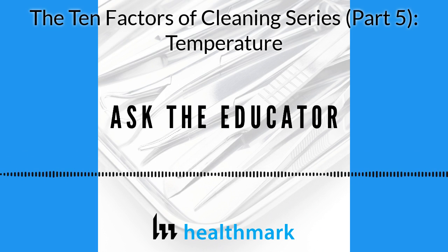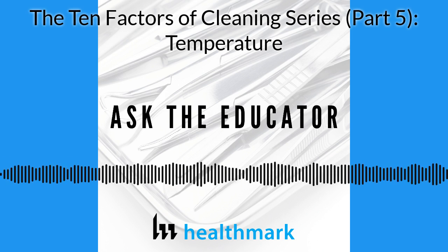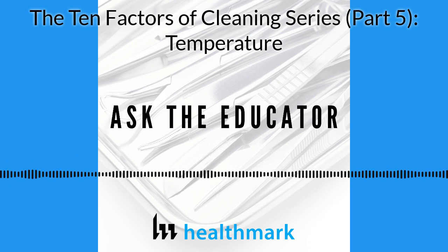Oh, okay. But see, that brings back that other factor, the IFU. You were following the IFU, which said what you needed to do, and it wasn't an important factor in the manual process. But when you go to your sonic, some have heaters, some don't. What is the temperature that the bath is?